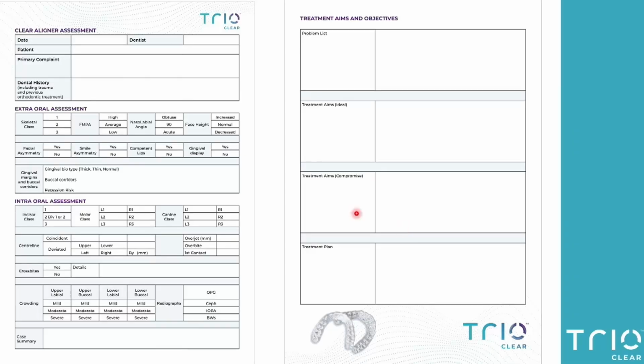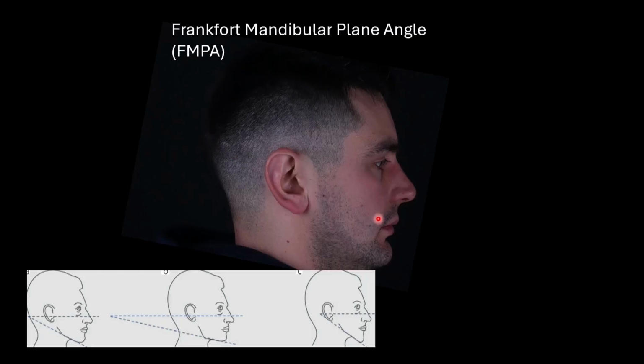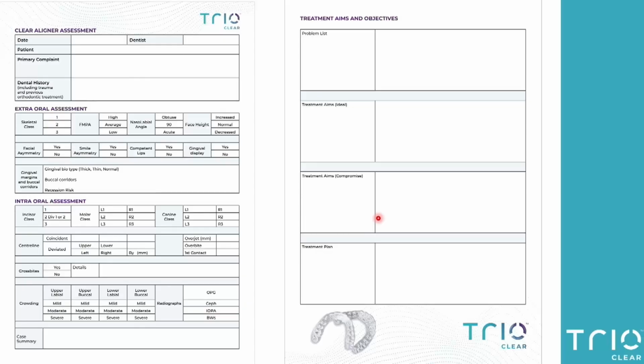Back to face height. So we talk about face height in this case, increased, normal, or decreased. In this case, it is slightly decreased, but it's not too far off normal.